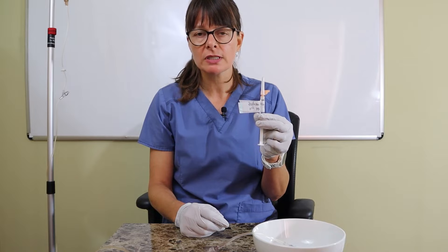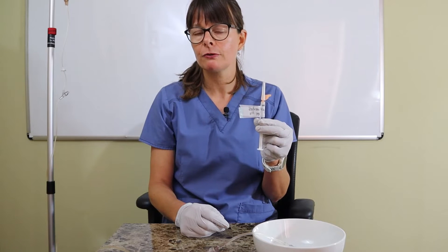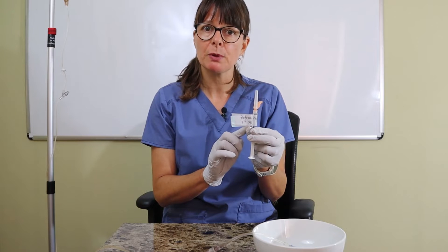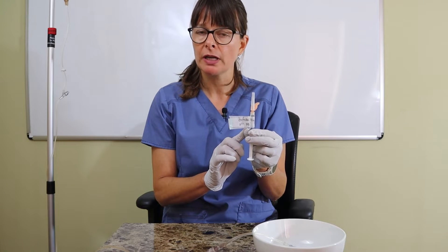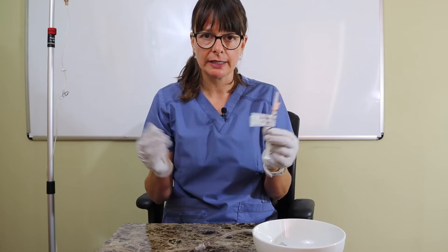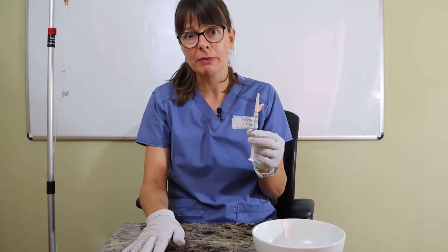The other thing that I always need to make sure is that the IV fluid that the patient has as maintenance fluid is compatible with the medication. I've already ascertained that that is the case because we have normal saline here, and that is compatible with pretty much everything.